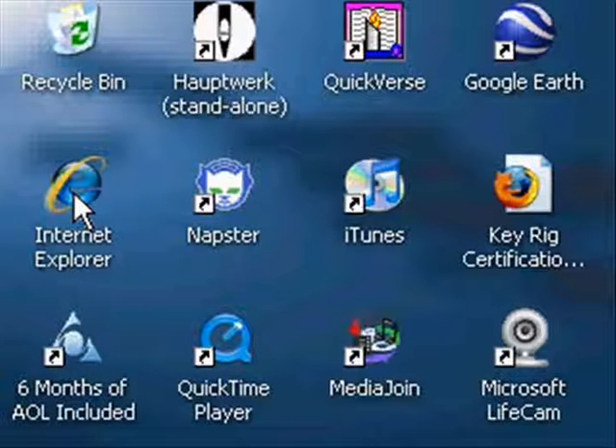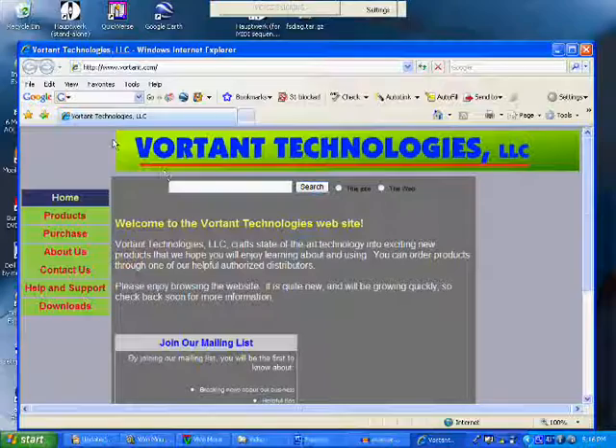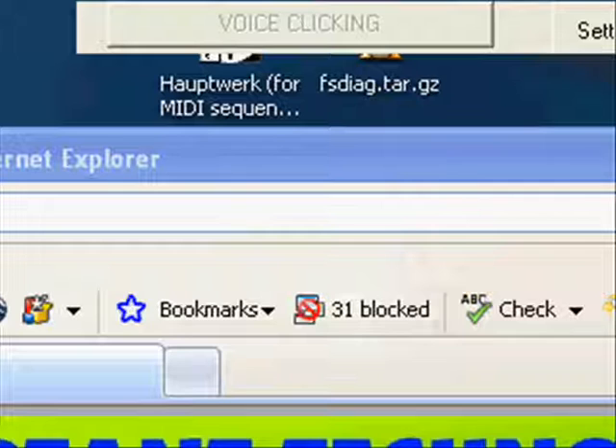The easiest way to click is if you are using a speech recognition program such as Dragon Naturally Speaking. When starting Internet Explorer, a double click is needed, so you would say "Tracker double click." This kind of clicking is called voice clicking. If you look at the VivoMouse control bar at the top of the screen, you will see that it is in voice clicking mode.